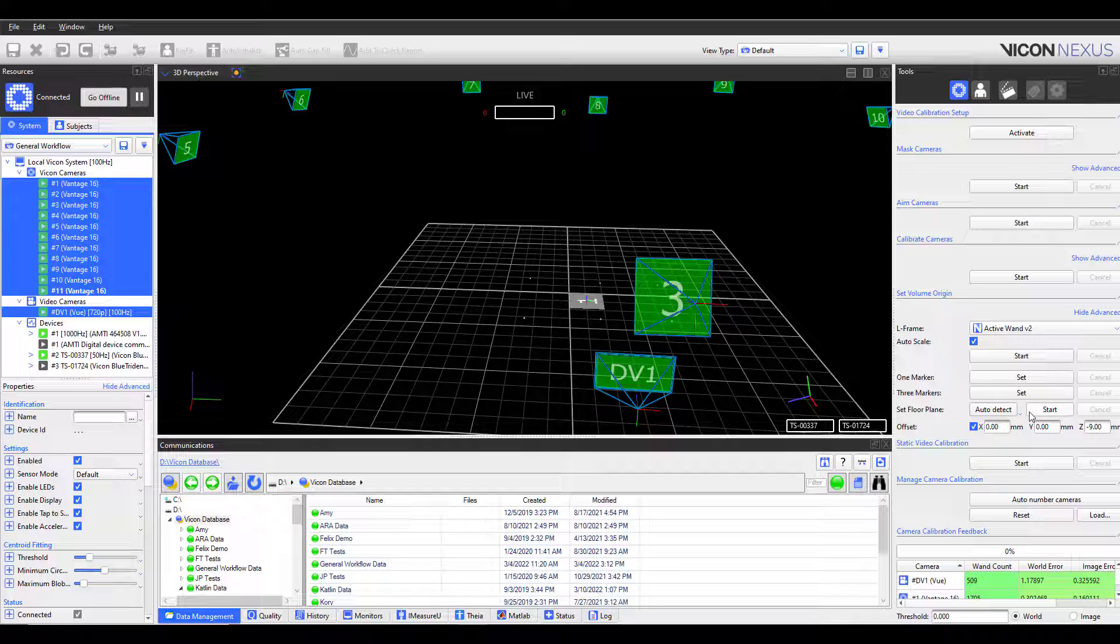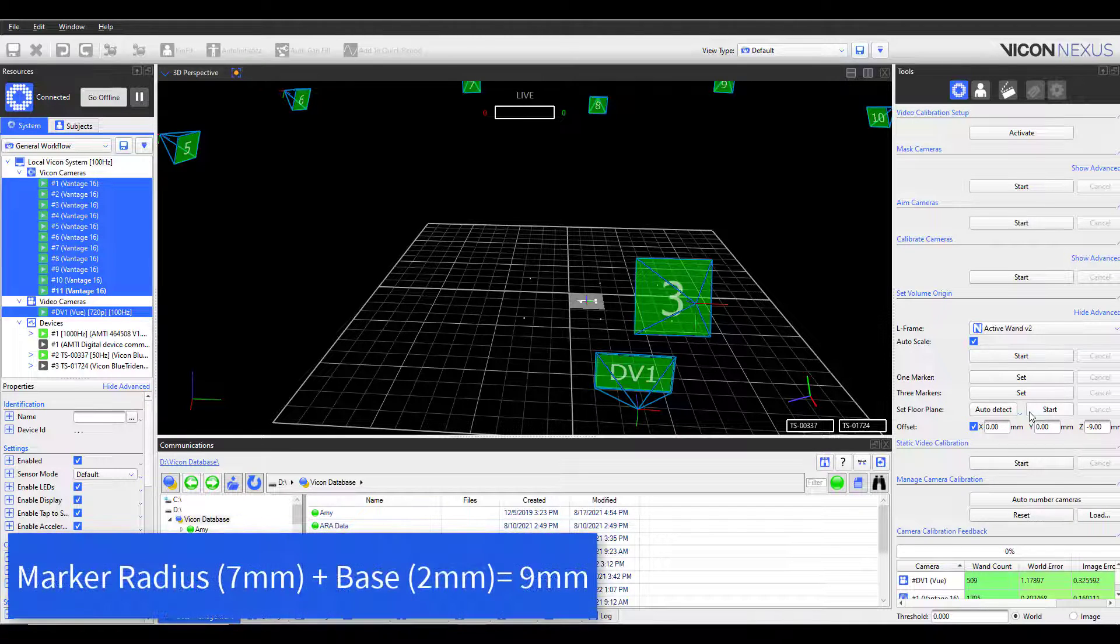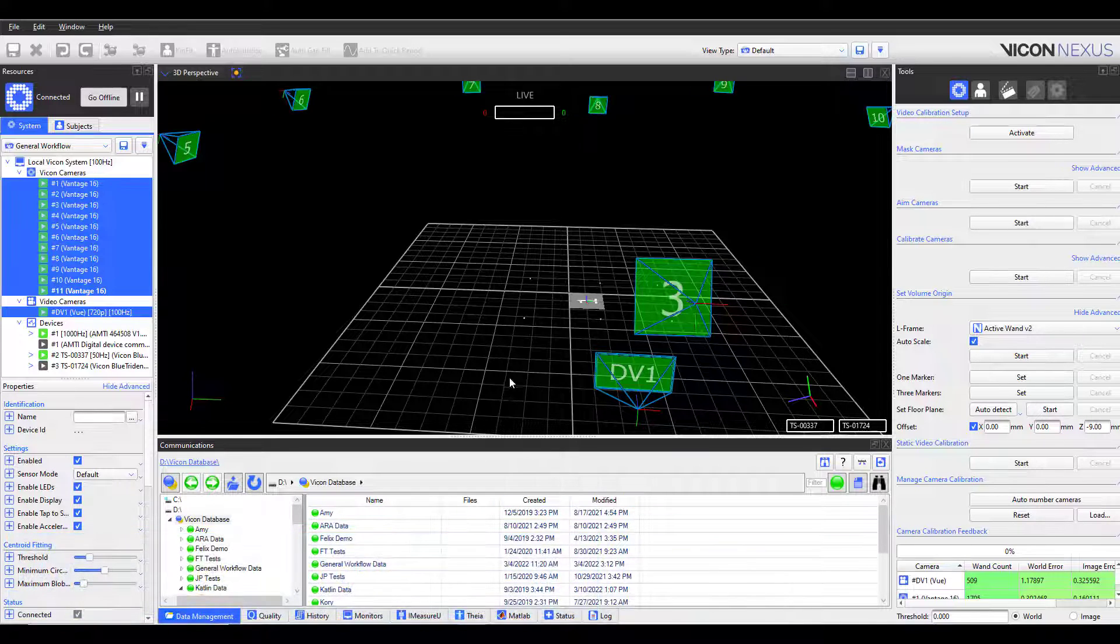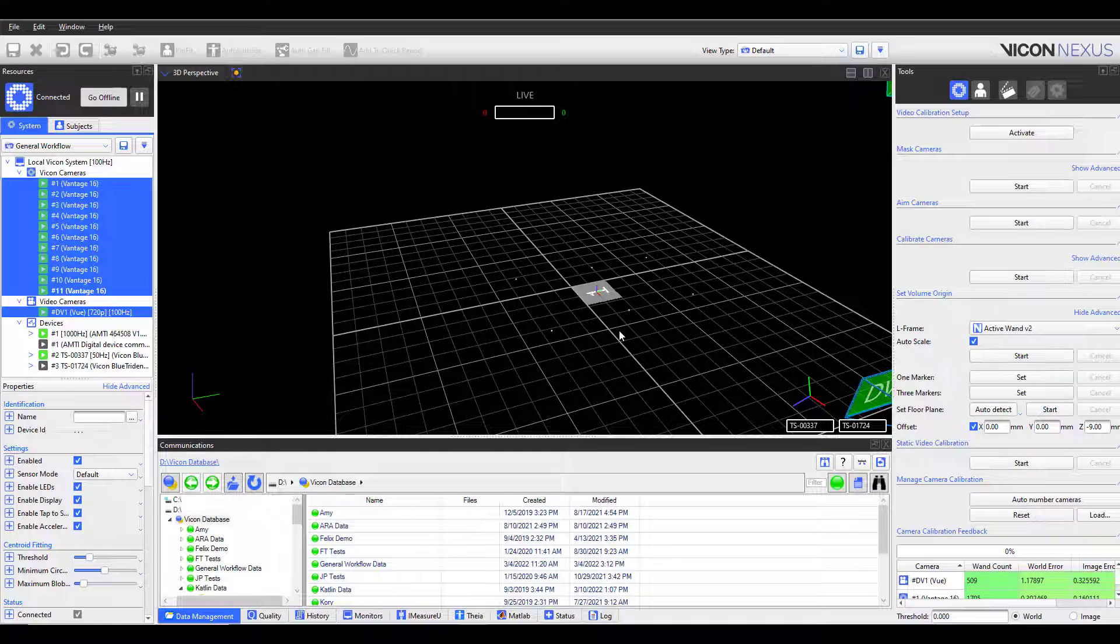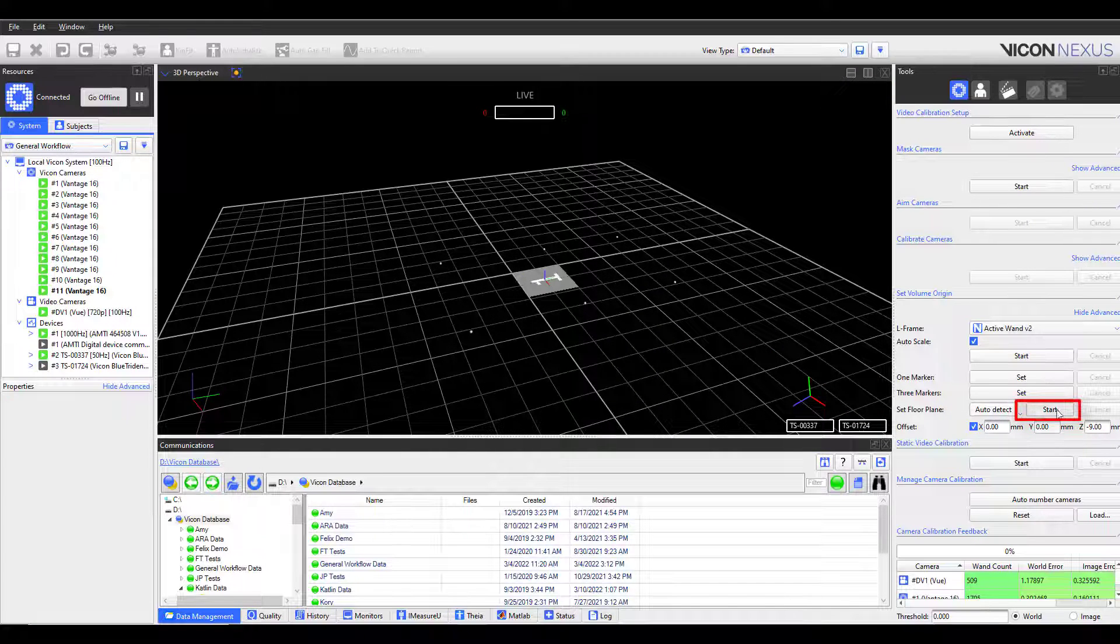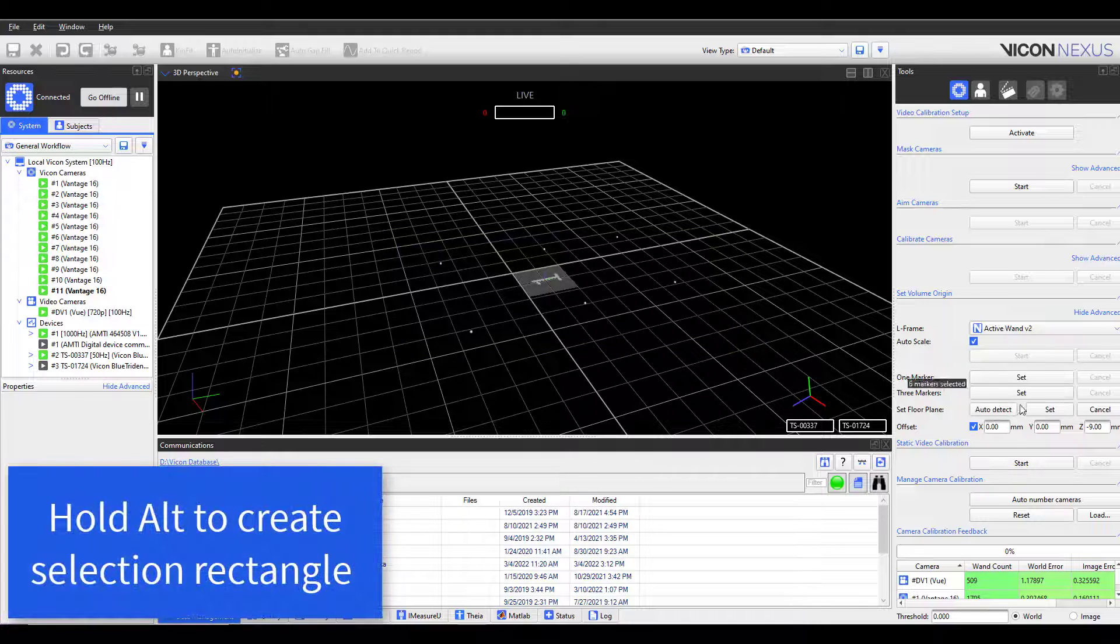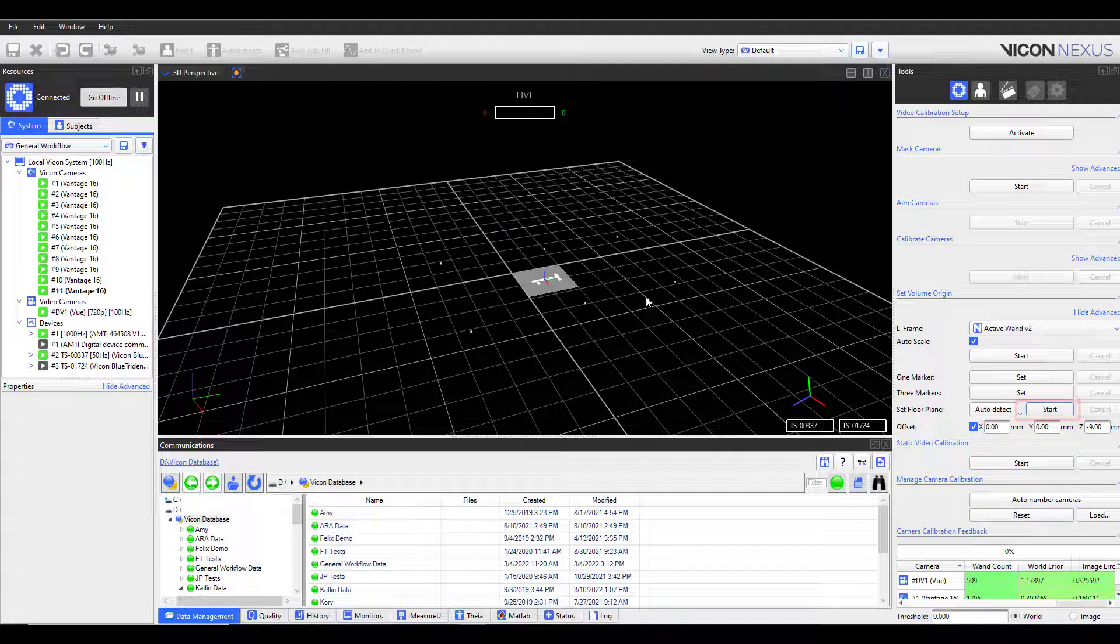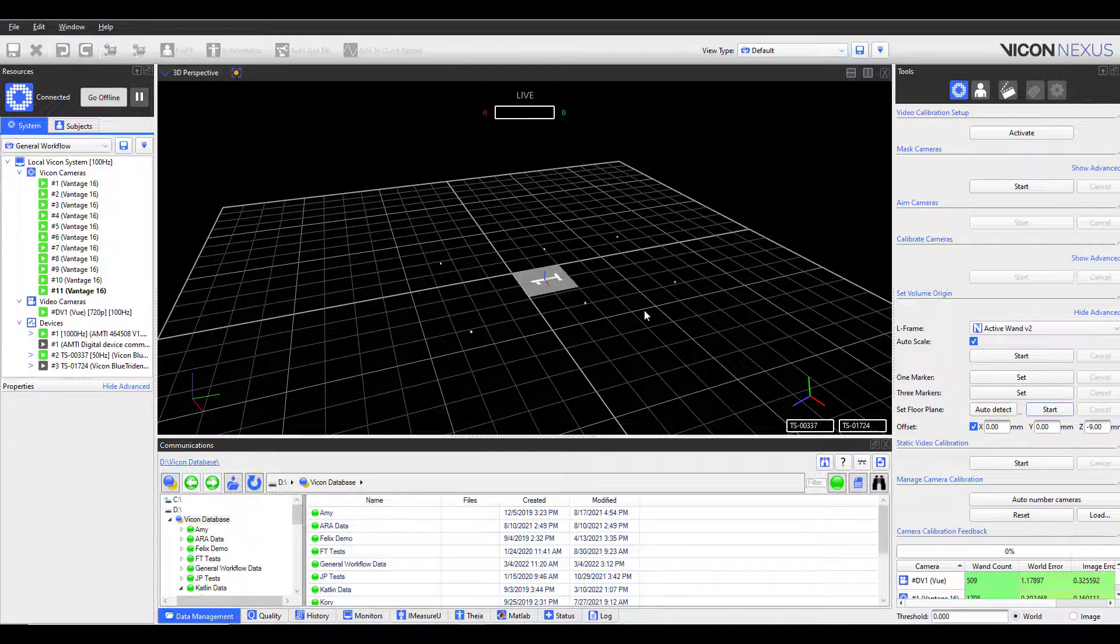So the floor plane is positioned at the base of my markers rather than through the center, I need to input a Z offset that corresponds to my marker size. In this case, I am using 14mm markers with a 2mm base. So the offset would be the radius, 7, plus the base, 2, giving negative 9mm. I can manually select them by clicking Start and then selecting all of my markers. I can then hit Set. You may notice your floor plane shift slightly as I hit Set.